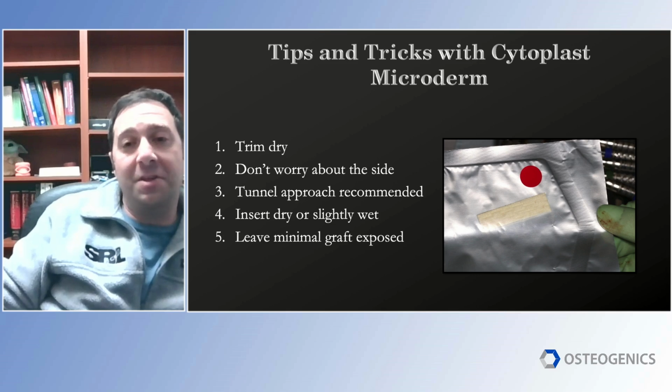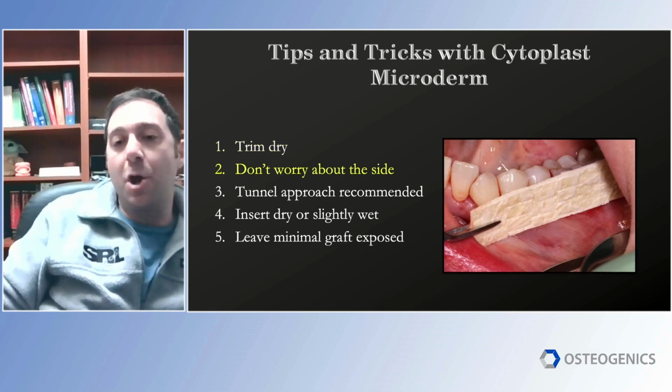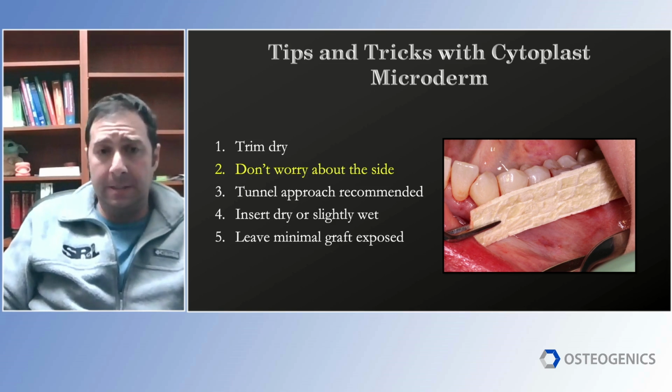So tips and tricks with Microderm if you're going to use it: trim it dry, don't trim it wet. It's much easier to handle when it's dry. There is no side specificity. There's no basement membrane side. You can use whatever side you want with the material.